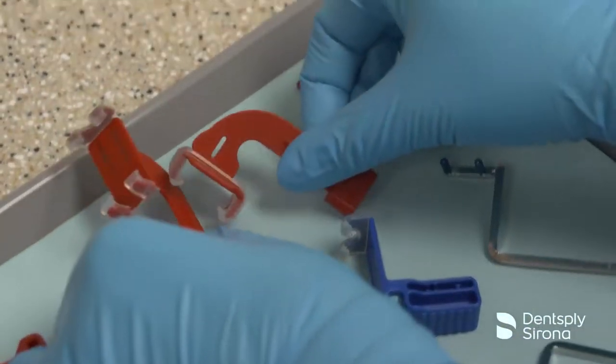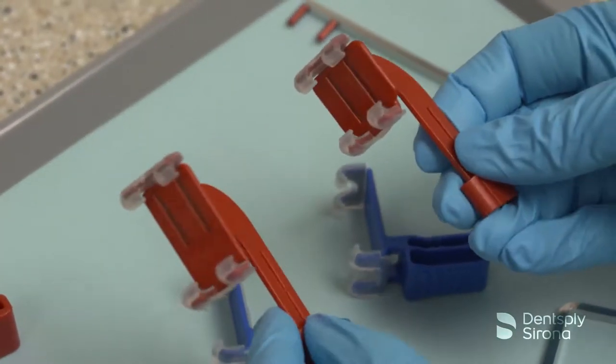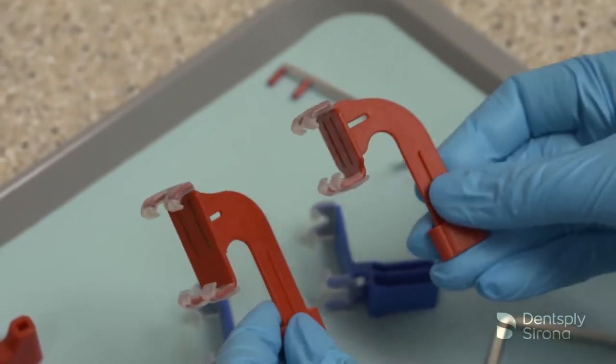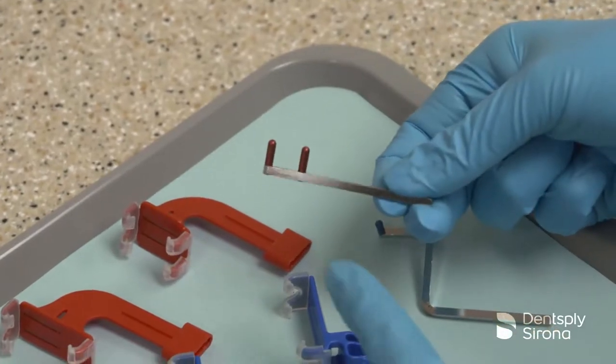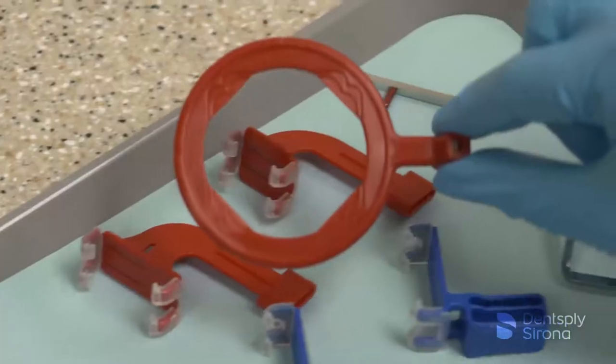The red bite block is used for bitewing radiographs and is available in a horizontal or vertical orientation and corresponds with the metal arm with the red pegs and the red ring.